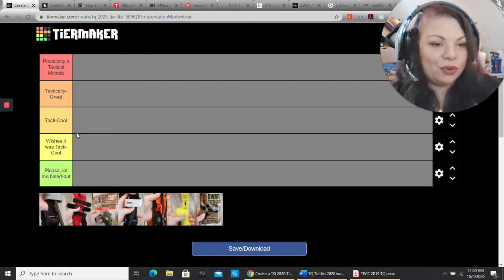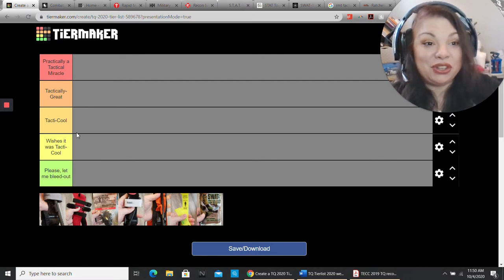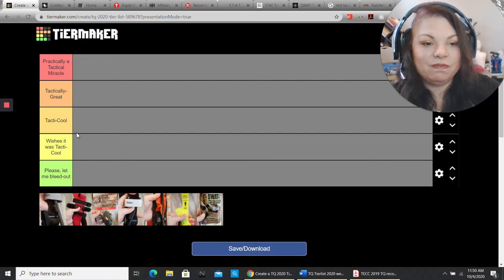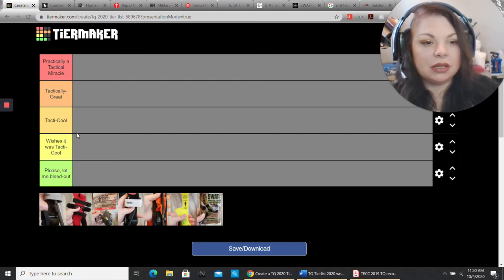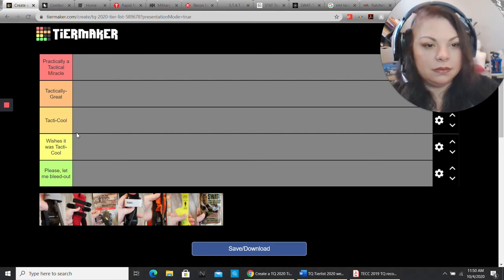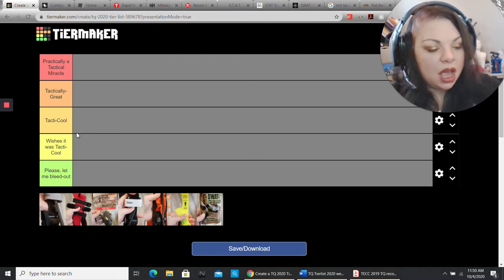How durable is it? Because the last thing you want is a tourniquet that's going to break on you. There's one in particular, two actually, that I'm looking at for that. Not breaking is important.